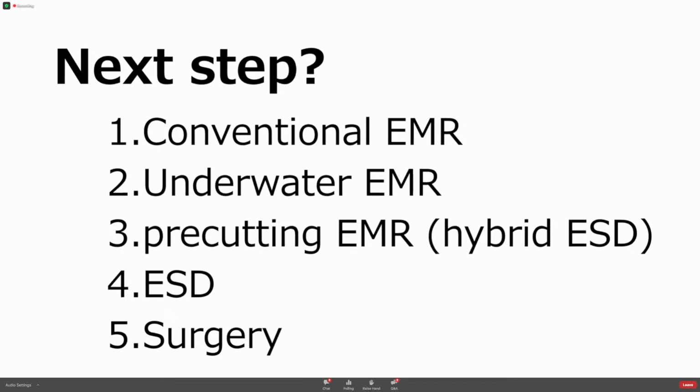Yes. So Dr. Kawamura, I have a question. Before the procedure selection, the considerable thing is the region location, which is in the cecum area, and the previous hospital showed the non-lifting sign. I wonder how that makes it not easy to select endoscopic treatment or surgery.